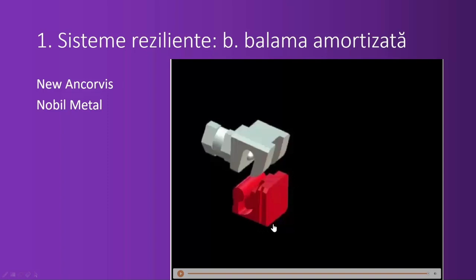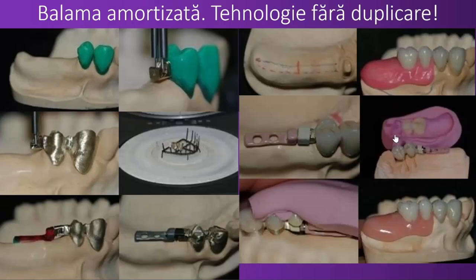So this is the patrix. It can be solderable, it can be overcastable, or it can be in plastic, castable, as this one. And the mobile part is the white one in our picture now, and that will be included in the saddle. So again, you see, the Italians, because this is Italian conceived and made, always model the teeth to the final shape, and then they trim out as much as they need for the part that will receive the ceramic.